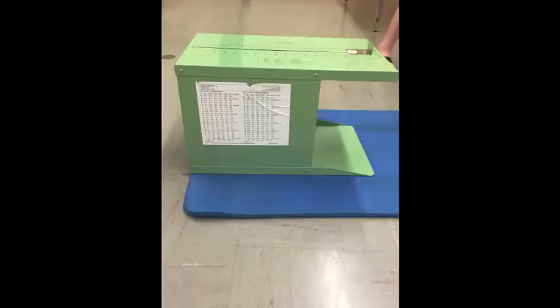Okay, so before you begin, you want to make sure you have your client take their shoes completely off. You want to have their feet flat up against the platform of the sit and reach box at the 26 centimeter mark. The box we're using is 23 centimeters, so we'll talk about the conversions and what we need to do for the scores later after the video. Also, you want to make sure the inner soles of their feet are within 2 centimeters apart within the measuring scale.